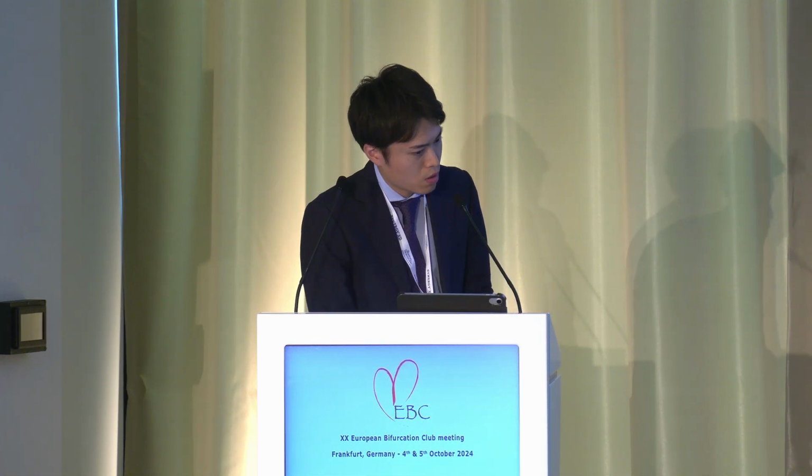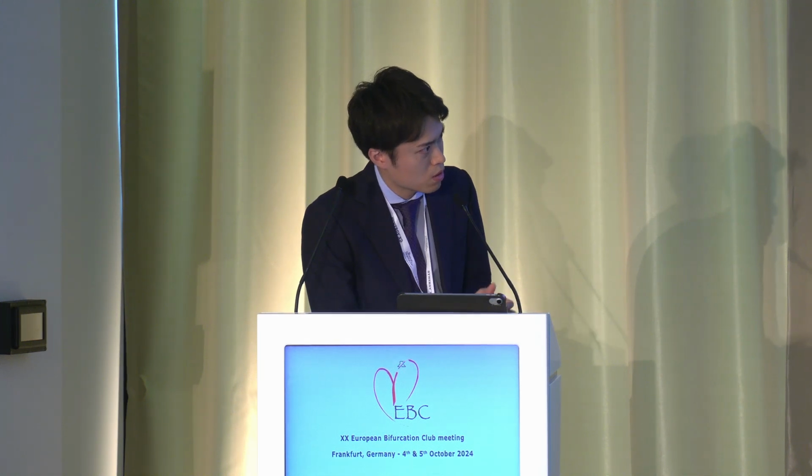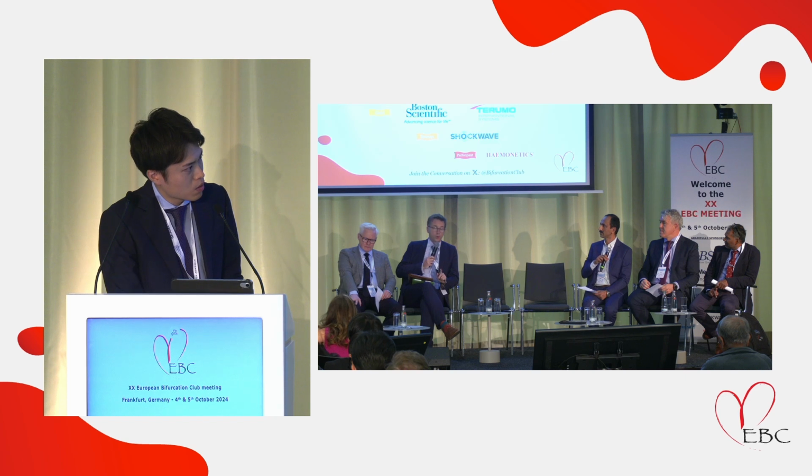No, not EEM, between the lumen borders. So you might be missing the plaque there. So if you're taking the lumen diameter, you might be missing the plaque in the side branch. In which case, as Dr. Johnson has told, IVUS would have given a better idea about side branch diameter and plaque. Well, the focus of plaque tends to be on the opposite wall to the bifurcation as a predictor for the compromise, rather than at the level of the carina or into the side branch.